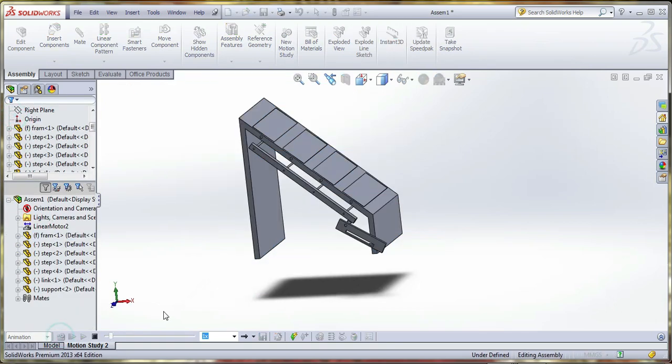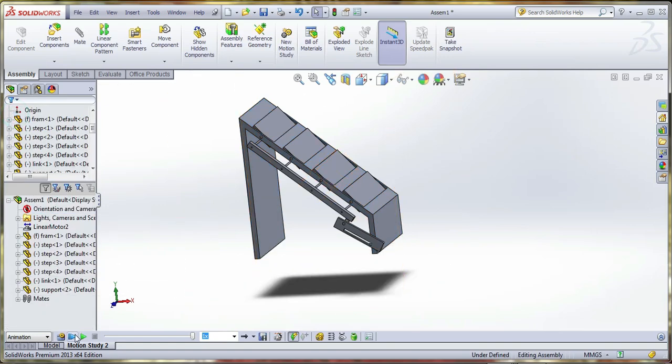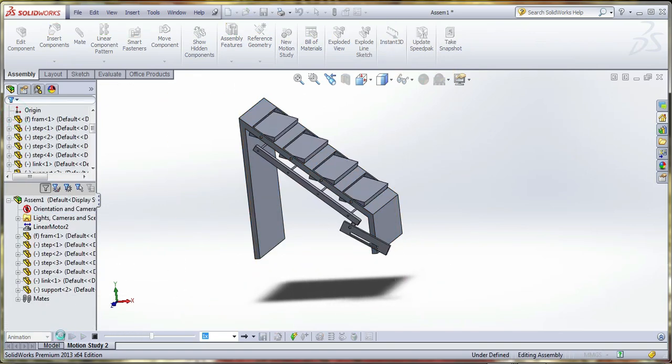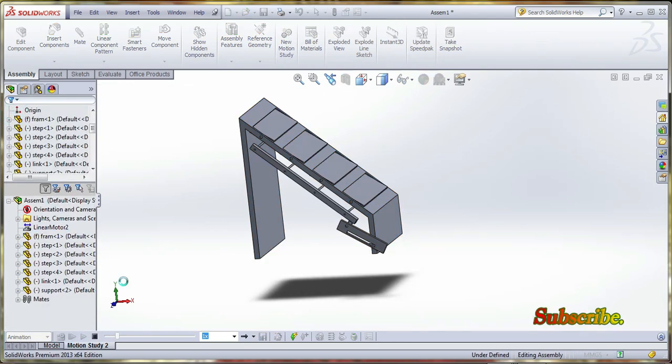Okay, again it is moving in the opposite direction. Now we're going to edit and change the direction. Nice. Now okay, it is a correct oscillating motion of these steps. And then we can change the distance to 15. Okay, excellent. It should be animated.